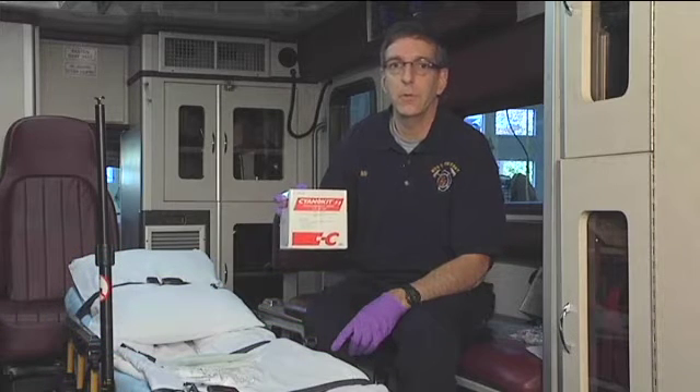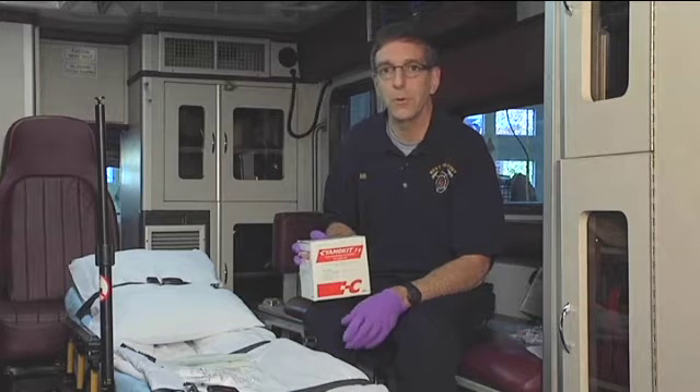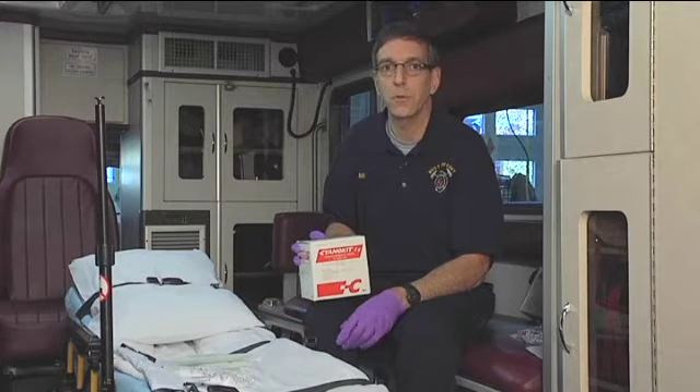Welcome to Training Minutes. Today I'm going to talk about how to set up and administer a Cyanokit, a cyanide antidote kit, used by firefighters and EMS providers who treat victims pulled from a structure fire with smoke inhalation who are in extremis, or serious condition.